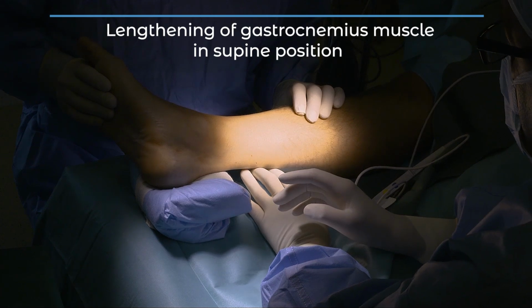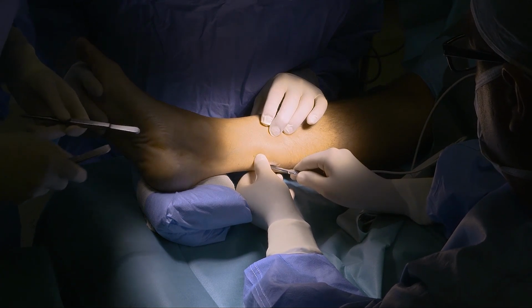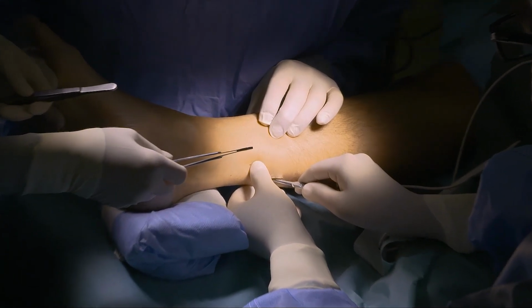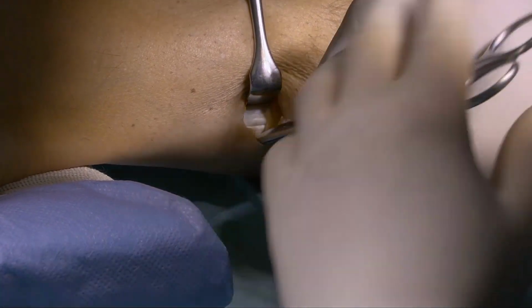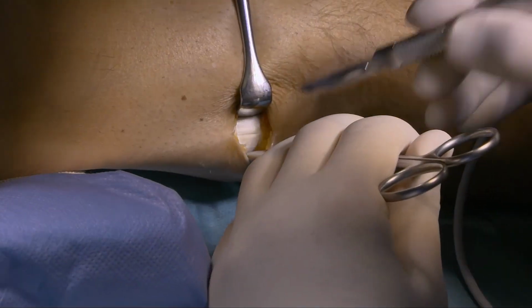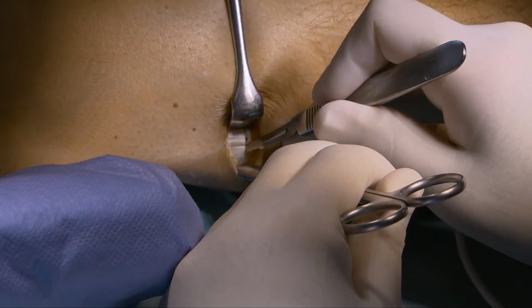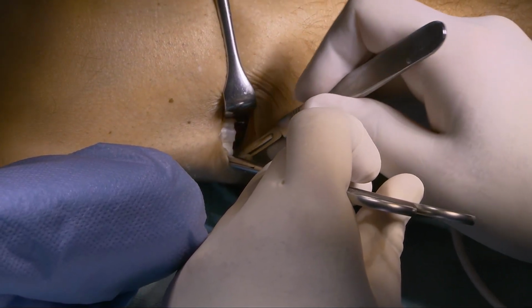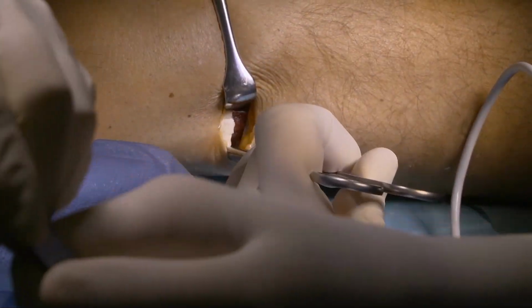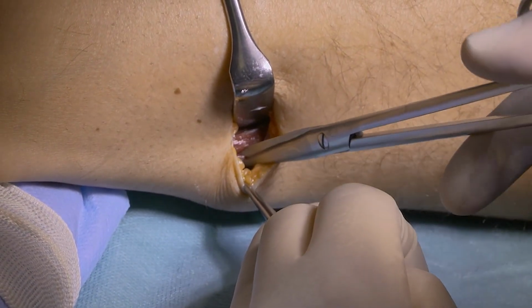The operation begins with the elongation of the gastrocnemius muscle. The patient is lying on the operating table in a supine position. Access to the muscle is between the middle third and the distal third of the shin. The muscle is cut transversely. It is also worth cutting through the tendon septum shown on the video.